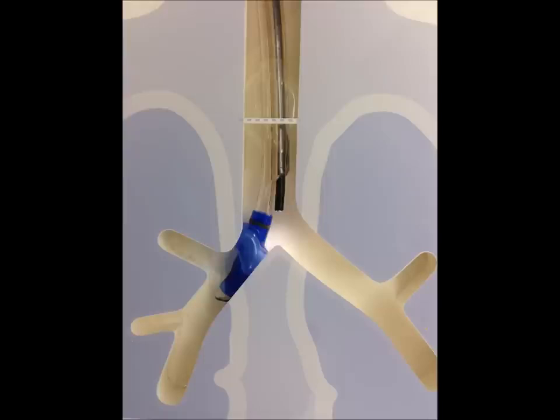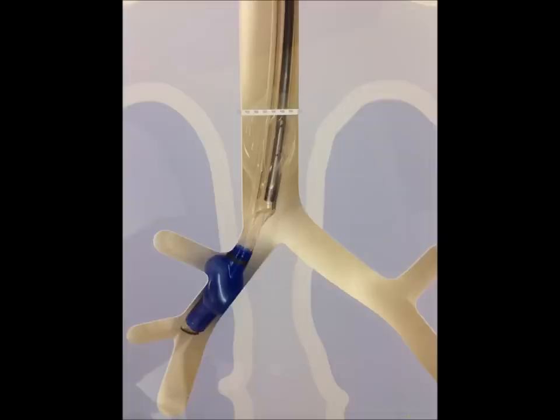You can confirm its placement by going down the tracheal port, seeing the carina, and seeing that balloon just distal to the carina. If you are doing a left-sided case, you can ventilate through this port. It's just much more difficult to get this side correct. As a matter of fact, most of the residents who have come out of their residency state they've never inserted a right-sided endobronchial tube. Here's a right-sided endobronchial tube which has gone down too far, and it is completely blocking the right upper lobe. So now you're ventilating really just the right middle and right lower.